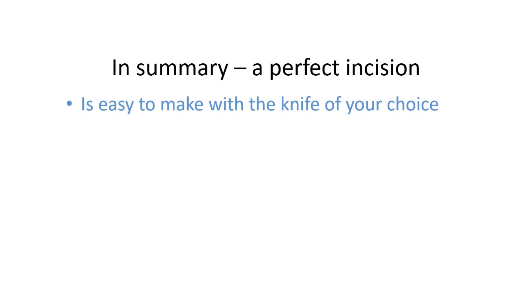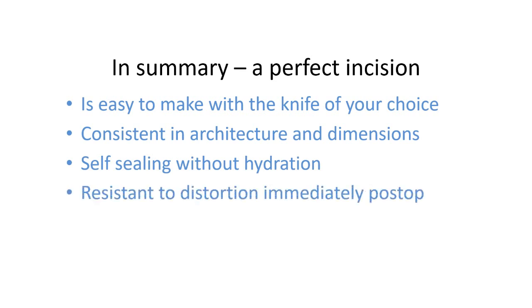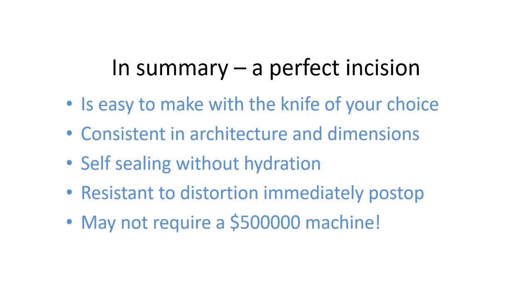So in summary, a perfect incision is easy to make with the knife of your choice, needs to be consistent in architecture and dimensions, self-sealing without hydration, resistant to distortion immediately post-op, and may not require a $500,000 machine.